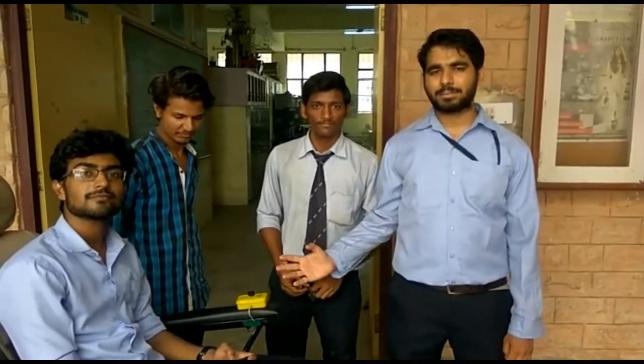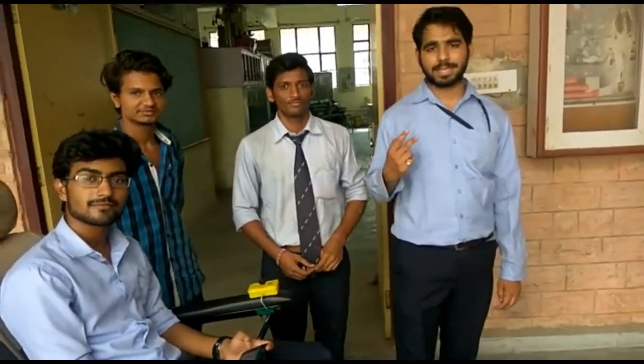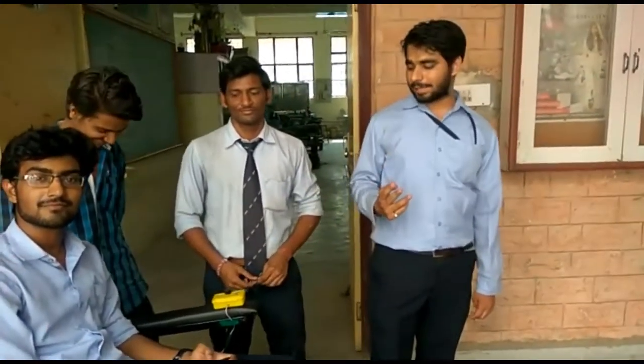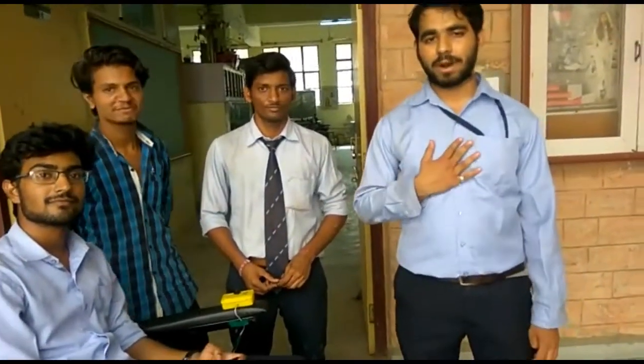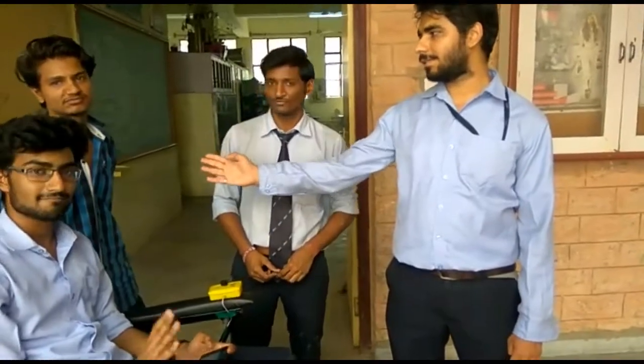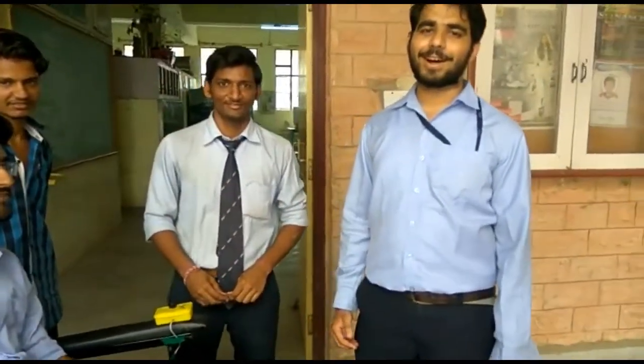This is our final year project: a smart wheelchair. It is controlled by two modules — one is the joystick module and the second is the Bluetooth module. This was made by five of us: my name is Naveen Kumar, he is Raghad Singh, he is Rajesh Yangar, he is Saurabh Radha, and the cameraman is Rahul.